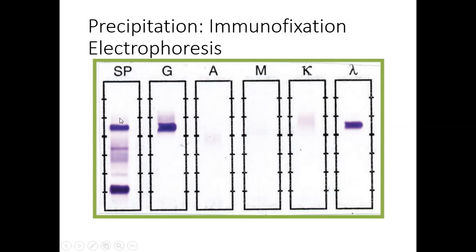So we're going to overlay a really diverse antisera that contains all the serum proteins that we need. And where the precipitates form, first when we applied it to the well, we migrated the antigen, and then we migrated it to meet the antibody that we placed on top of it.